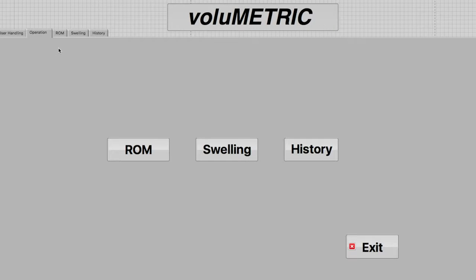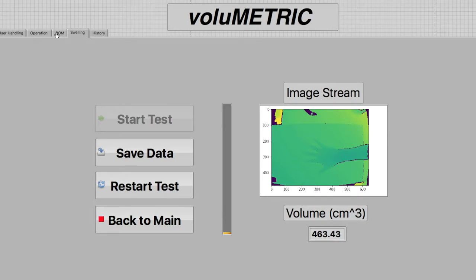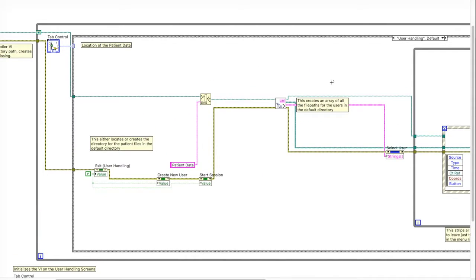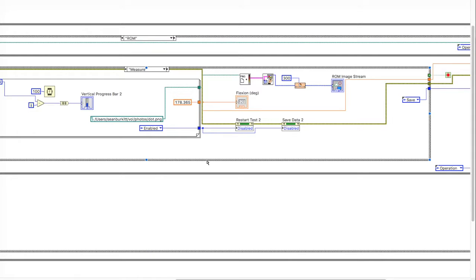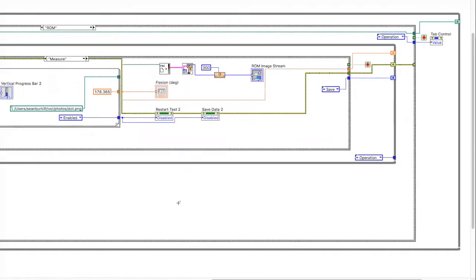We designed the VI in LabVIEW to be as modular as possible to make the addition of new utilities as easy as possible. To accomplish this, we used the tab control. That way, if we wanted to incorporate a new test or new utility into our program, all we had to do was add a new tab. This also compartmentalizes the block diagram by having all of the programming associated with one of the tests placed together in one case structure within the main while loop.